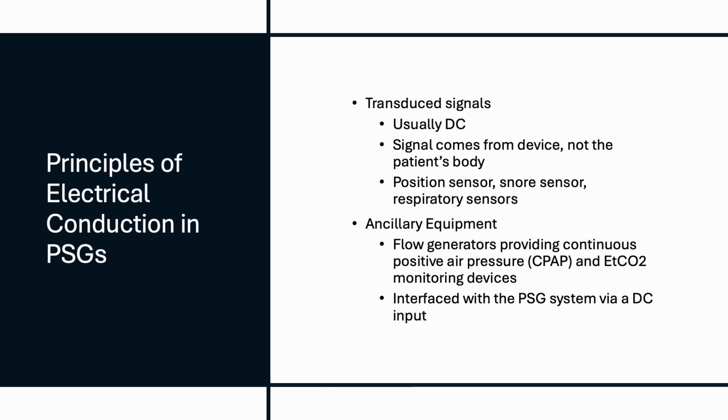Alternately, we can take man-made electrical signals out of something the patient does that we want to measure. Transduced signals are electrical signals that have been converted from a different form of motion or energy to be recorded on the PSG.